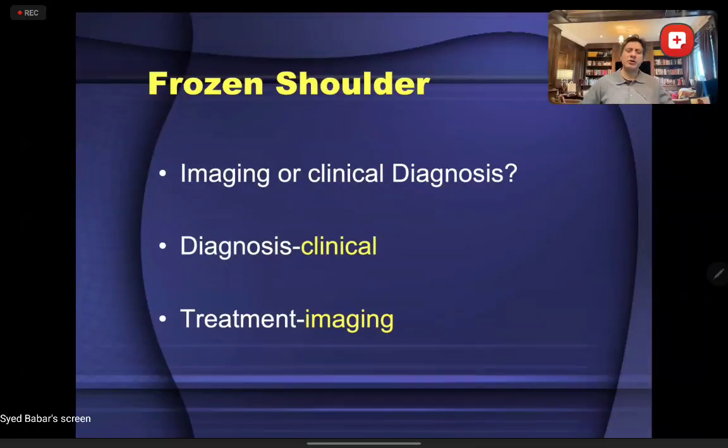Okay, frozen shoulder. I don't think we need to go too much. You've already seen a case of frozen shoulder, but remember it's a clinical diagnosis. Right, let's look at a couple of cases in the last 10 minutes. Any questions so far?